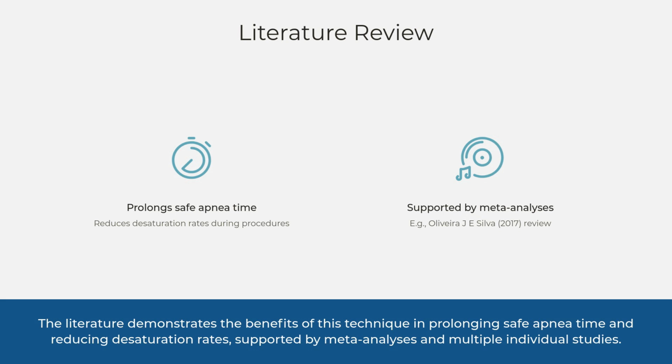To sum things up, here's the playbook. Pre-oxygenate with a mask and nasal cannula at 15 liters per minute. Post-induction, keep the cannula running, use a bag valve mask with PEEP if needed, and ensure airway patency. At intubation, remove the mask, but leave the cannula to keep oxygen flowing.